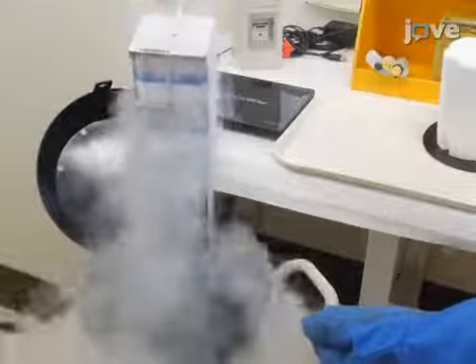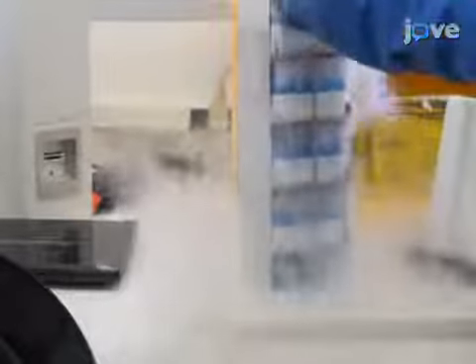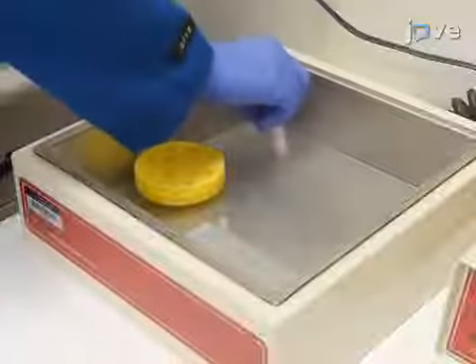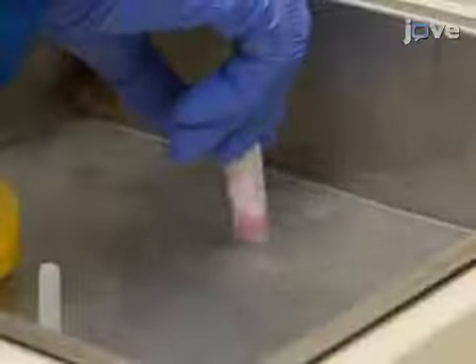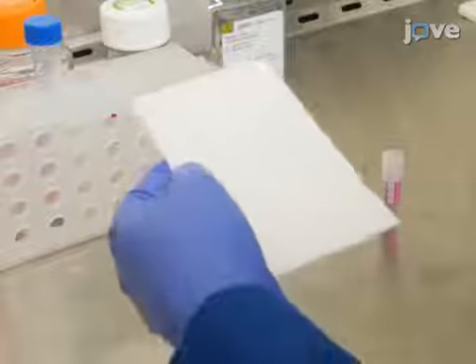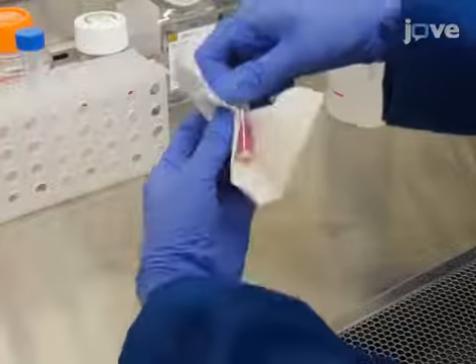To begin this procedure, remove a vial of cryopreserved HEI-OC1 cells from liquid nitrogen and place it in a water bath at 37 degrees Celsius. Submerge only the lower half of the vial and allow it to thaw until only a small amount of ice remains in the vial. In a biological safety cabinet, wipe the outside of the vial with 70% alcohol.